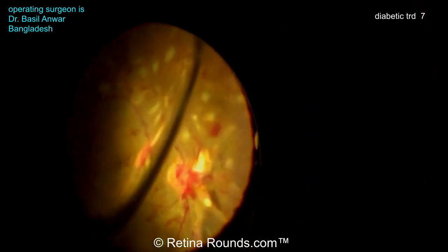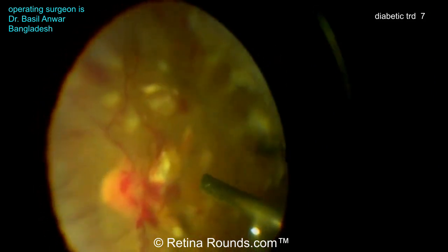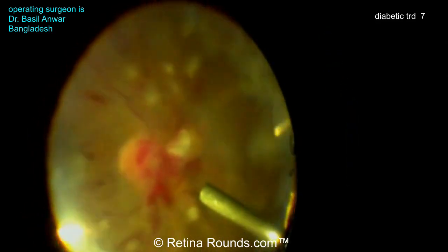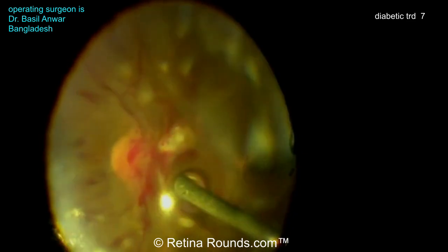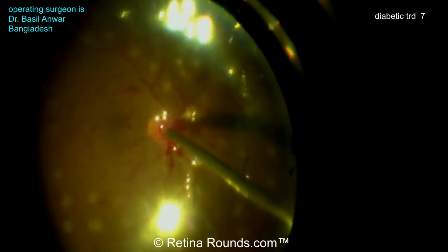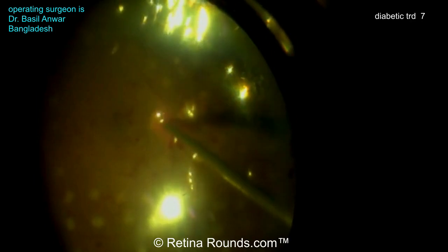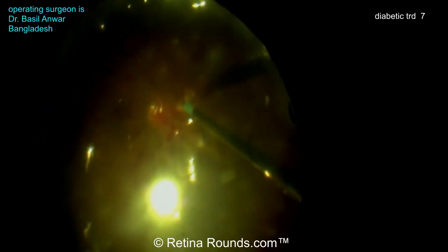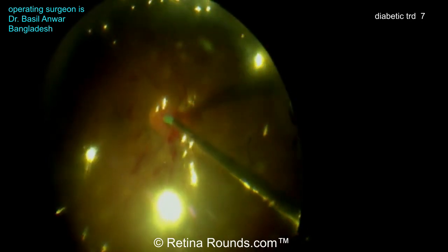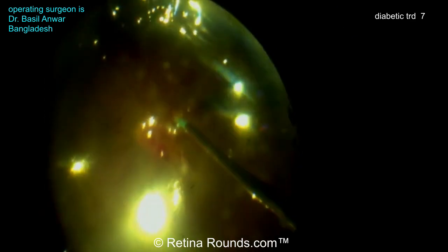Now we're going to go ahead and go to an air-fluid exchange. He's using the cutter here to initiate the air-fluid exchange, bringing that air meniscus down towards the optic nerve. You can see that the light reflux changes — when the cutter is in the water there's a shimmer of light reflux, and then when it changes again he knows he's in air. Now using the soft tip to dry the retina. It looks like there might be a small iatrogenic break there, just nasal to the optic nerve. He's drying up all that pre-retinal fluid over the optic nerve and draining any fluid underneath the break.